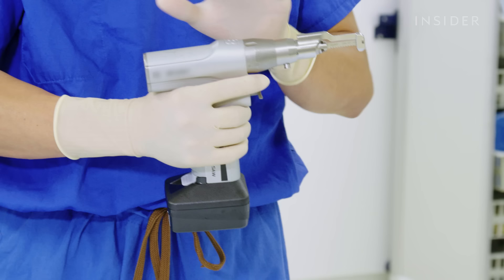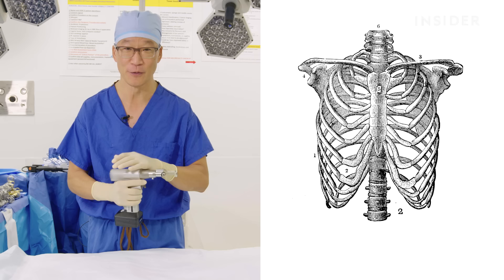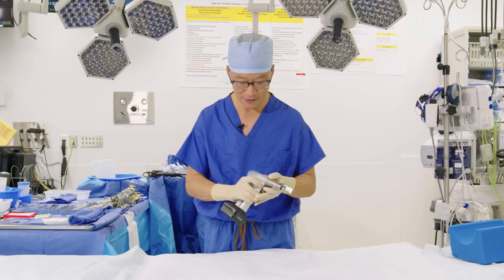Probably one of the most dramatic instruments that we use is the sternal saw, and this is the instrument that allows us to go through the breastbone in the middle of the chest to get to the heart. It's very similar to a common jigsaw that you use for home improvement.